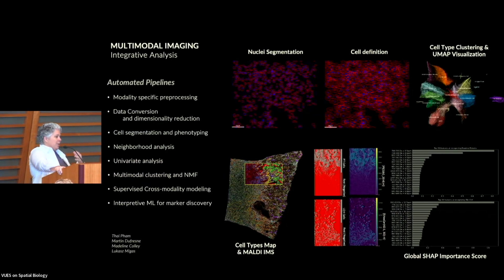But that then brings up the next question of, if we're describing cellular neighborhoods, but we're only sampling in the X and Y plane, are we truly describing cellular neighborhoods? Because the cell obviously has neighbors in all 3 dimensions. And so that's what's really driving us to the next level, which is, can we start to build 3D volumes from all these 2D assays that we've developed?